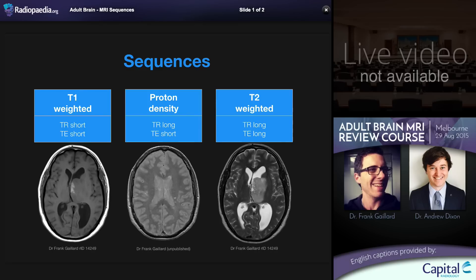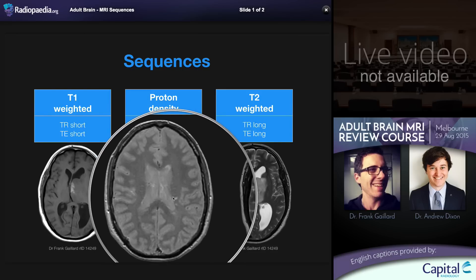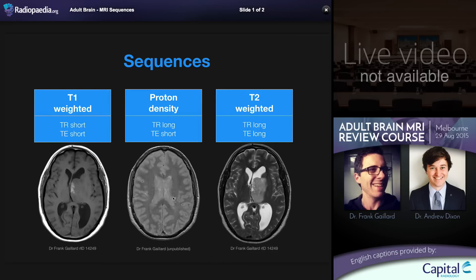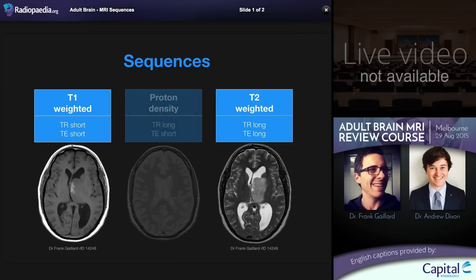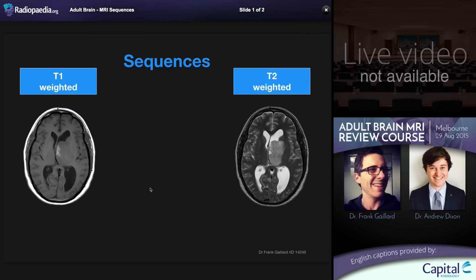Proton density is an intermediate sequence characterized by a long TR but a short TE. It had appearances that were very useful in the early era of MRI for examining white matter, making white matter lesions easier to identify than on T2 or T1. The role of proton density has largely been superseded by FLAIR imaging, or fluid attenuated inversion recovery, to the point that very rarely is proton density performed in modern day brain protocols. It is worth noting, however, that proton density is still alive and well in other parts of the body, particularly in musculoskeletal imaging.